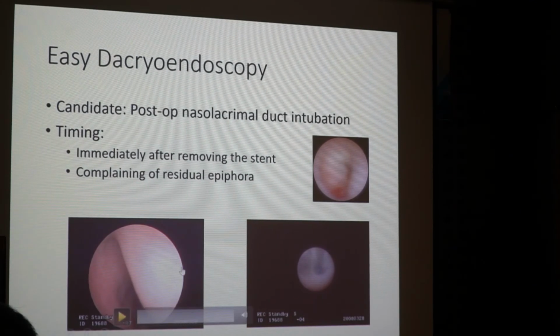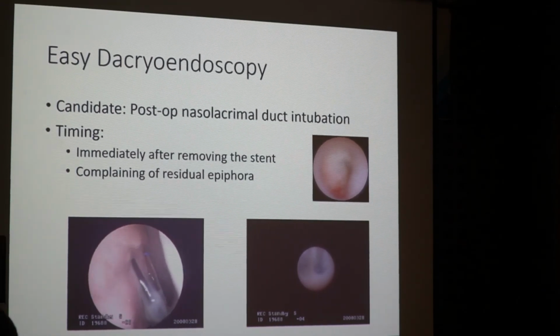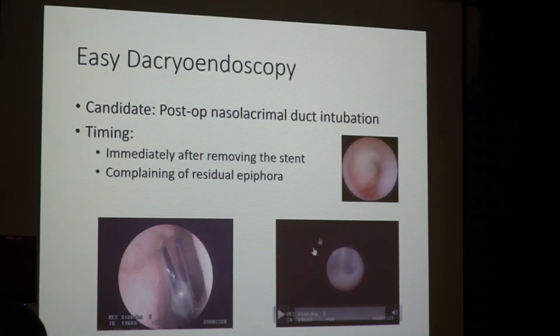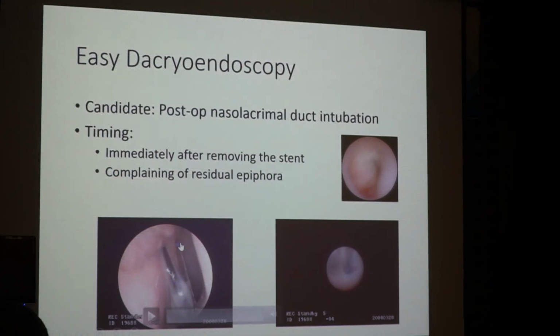And this example is very interesting. The patient came to see me complaining of residual epiphora. Even though having a lacrimal stent, she is still watering. And using nasal endoscope, seemingly one end of the lacrimal stent is coming from the original good track, but one end of the lacrimal stent is getting out of a false passage. So I thought one end was in a false passage.